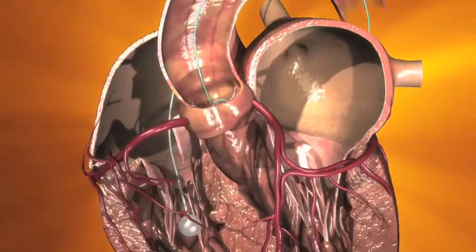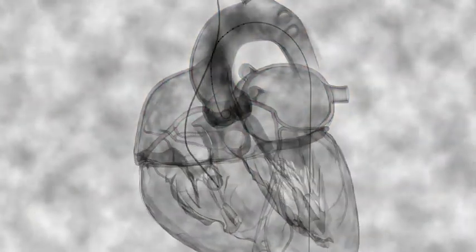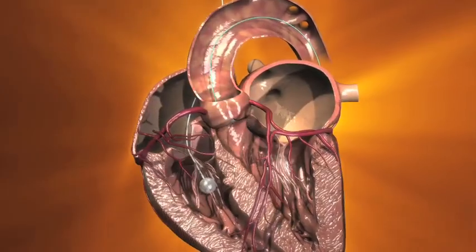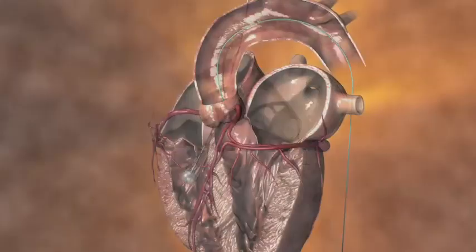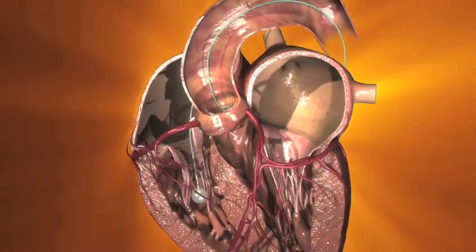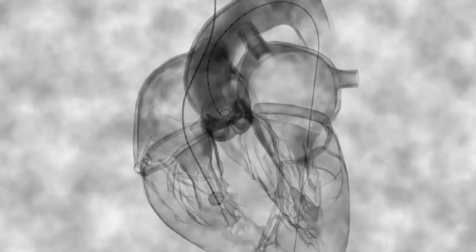Identify ideal annular viewing plane using small contrast injections at various angiographic angles. When ideal viewing plane is identified, perform aortography using a larger bolus of contrast. Please note, a dedicated individual should be assigned to prepare and operate the contrast injector.